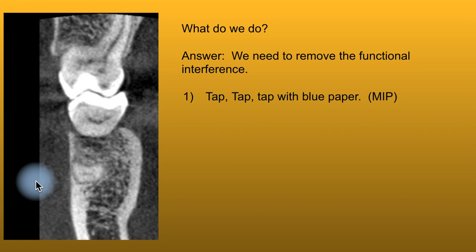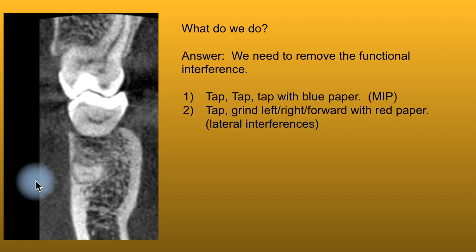So the only time our teeth come together is when we're actually in the swallowing pattern, which is a fraction of the day. It's really the functional motion that we want to gain more understanding of, and that's why I brought that concept up here. How can we gain more understanding of where that envelope of function exists? Well, the first thing we can do is start with a different color paper than the one that we had tap, tap, tap with. Here we're going to use red.